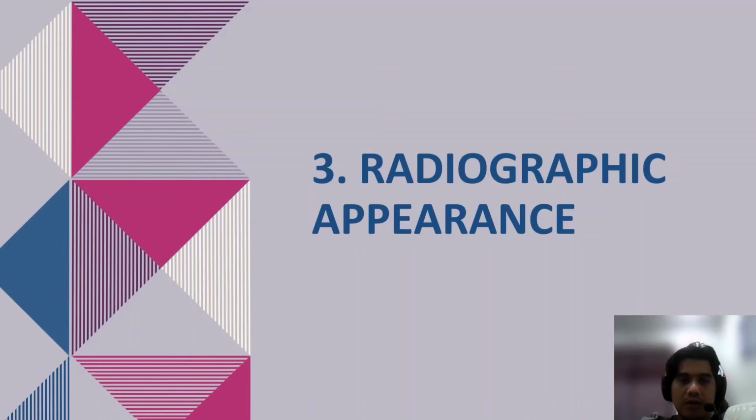As we know, lung scintigraphy is an examination to measure the blood and air supply to the lungs. It is the best non-invasive test to establish pulmonary embolism. Let me continue the presentation with the radiographic appearance.